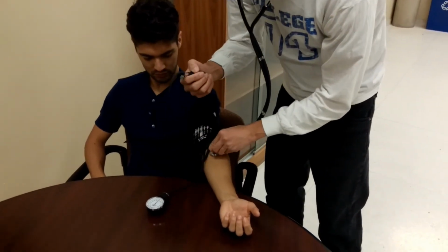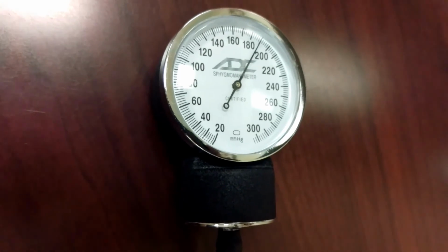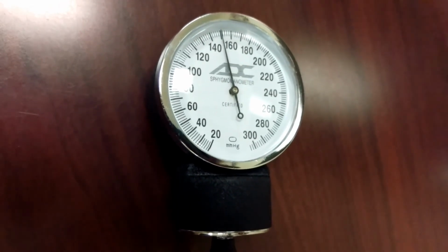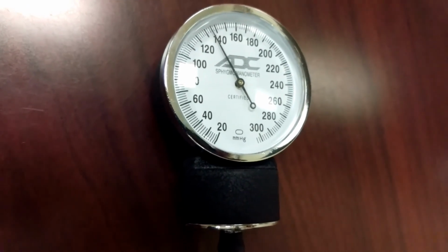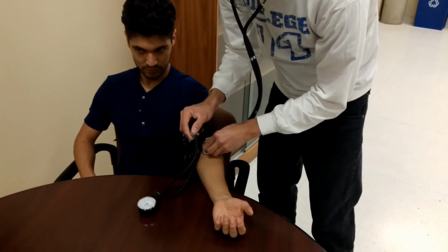Inflate to 180 millimeters of mercury or 20 millimeters of mercury above first Korotkov sound. Turn valve to the left to release at a rate of 2 to 5 millimeters of mercury per second. Time frame to wait between readings is debatable between 3 and 5 minutes.